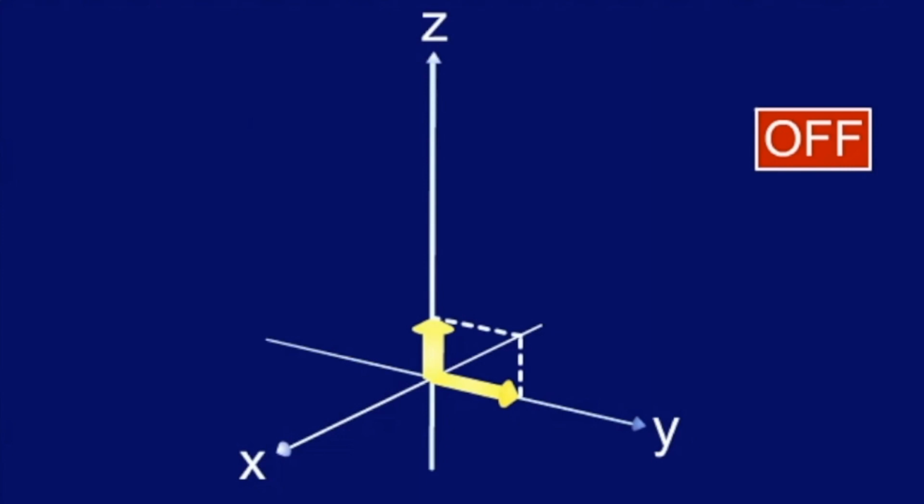If we do the same with the longitudinal and the transversal vector, we get the sum vector. This sum vector is very important, as it represents the total magnetic moment of a tissue in general, and thus can be used instead of the two single vectors, representing longitudinal and transversal magnetization separately.